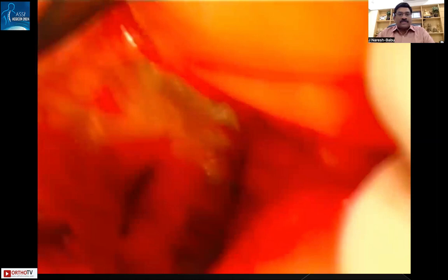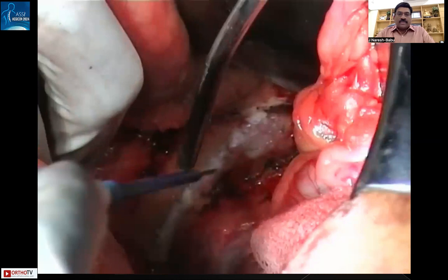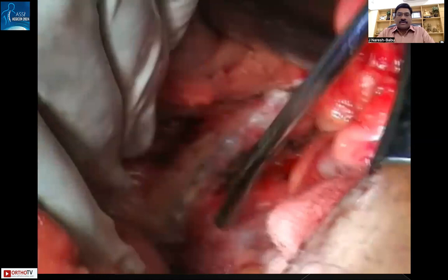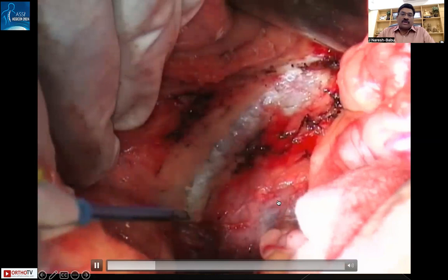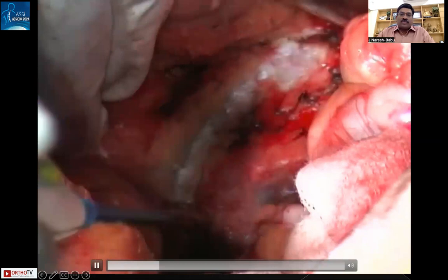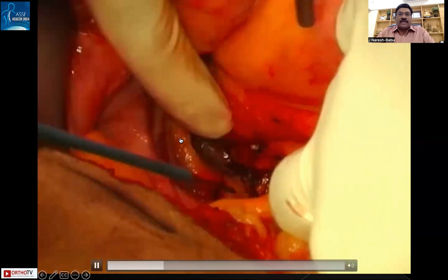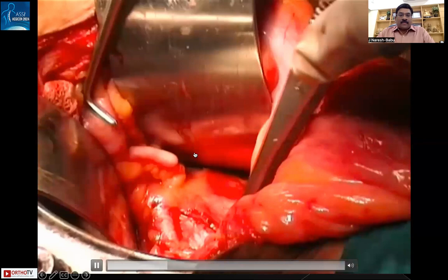The adhesions and mesenteric attachments are completely released, and you can see the pulsating vessels of the internal iliac arteries running on both sides. These internal iliac vessels must be ligated to reduce intraoperative bleeding. The rectum and other vital structures are separated from the tumor. This cricket-ball-like structure is the tumor, and you can observe how precisely it is being removed without touching the tumor capsule.